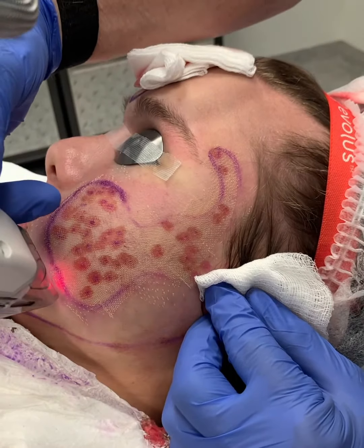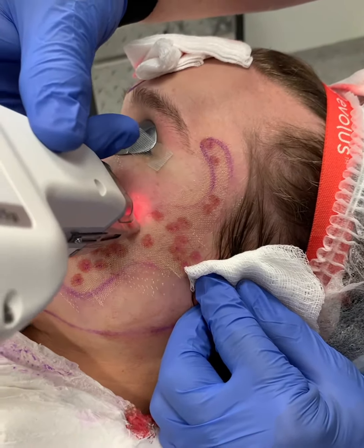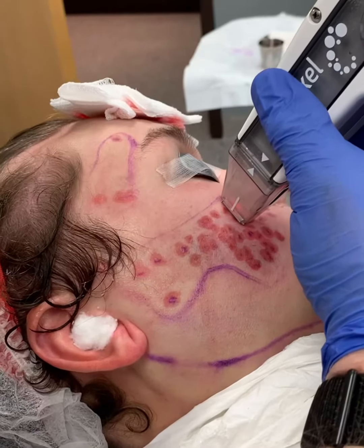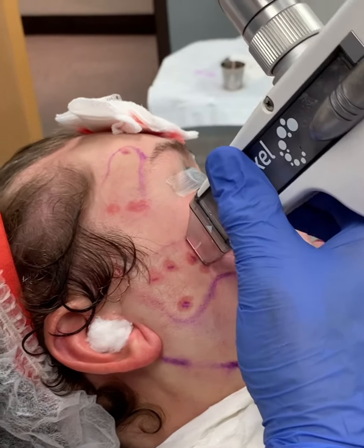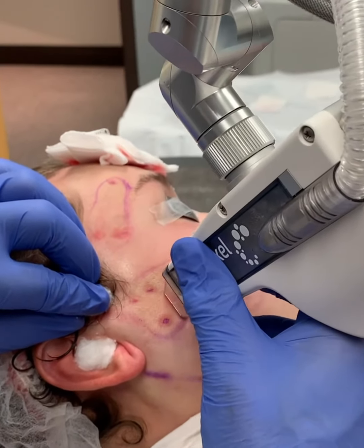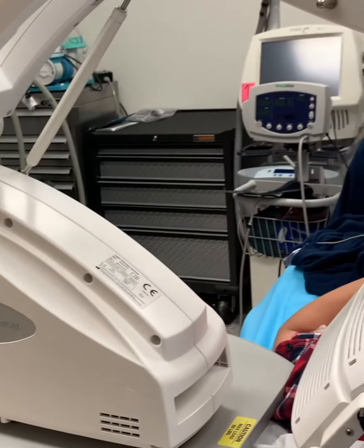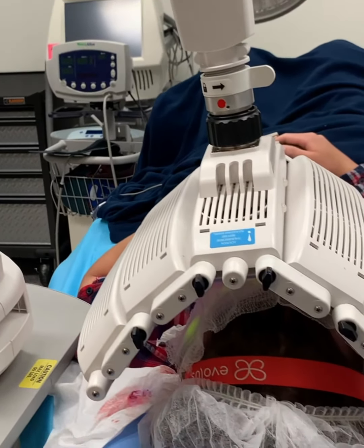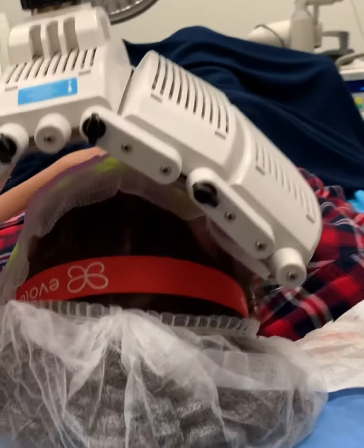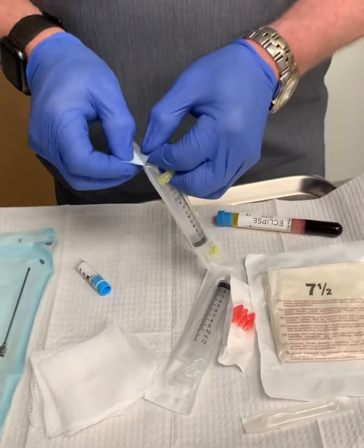During the time the blood is spinning, we use a fractional CO2 erbium or a fractional 1064 nanometer laser to do fractional ablative resurfacing on the area of the rolling acne scars. After doing that, we place an 810 nanometer diode light over the skin that reduces swelling and inflammation.